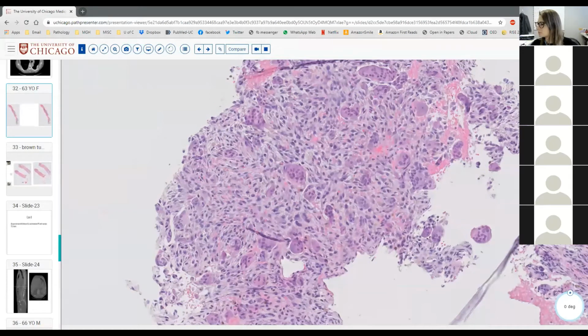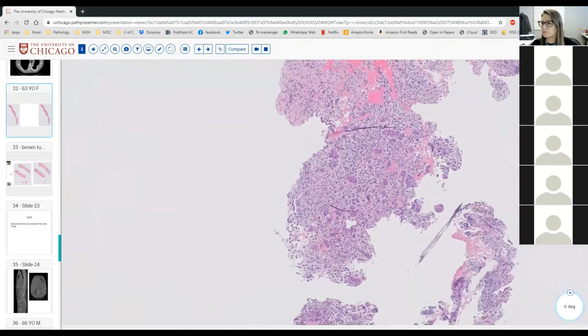First of all, we are not in the muscle. So I still think, because ABC doesn't like those pools of blood, the cystic spaces don't have a lining around them, and in a core it's hard to tell if these are actually cysts or extravasated blood. But I think a USP6 rearrangement can differentiate between these two. This is my very crude description and my two top differentials for this one.